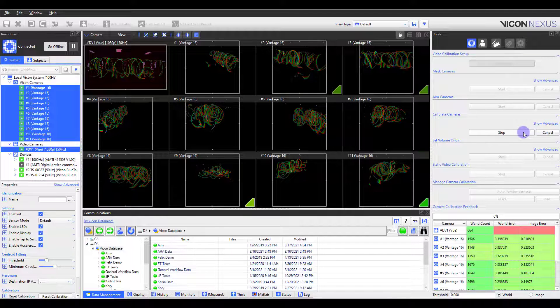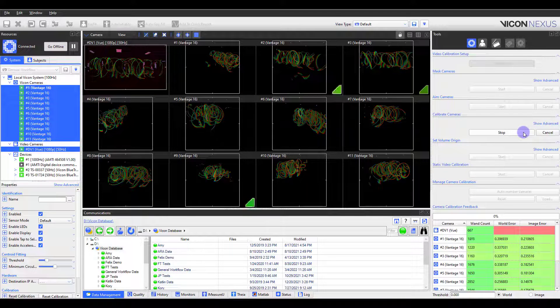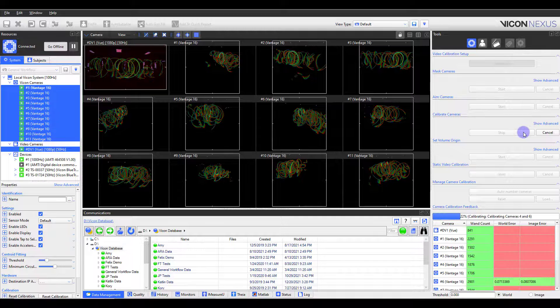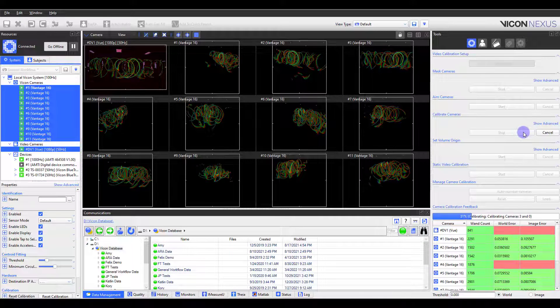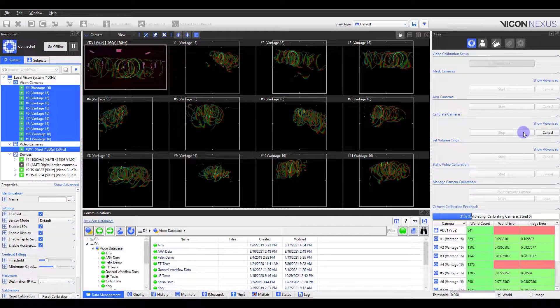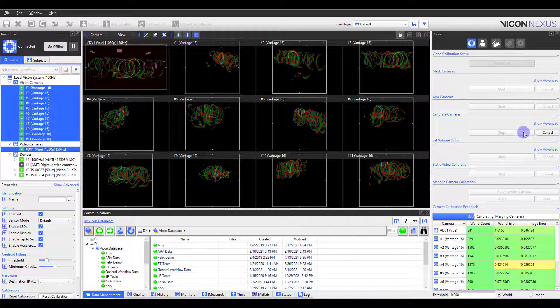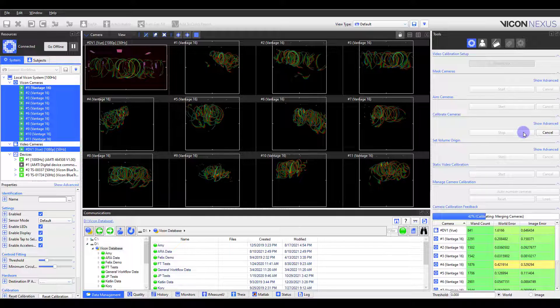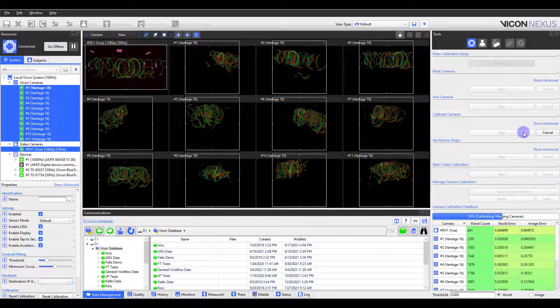If you have Auto Stop checked, your cameras will automatically stop calibrating once they reach the specified refinement frames. You can then place the wand at the origin and return to the computer.